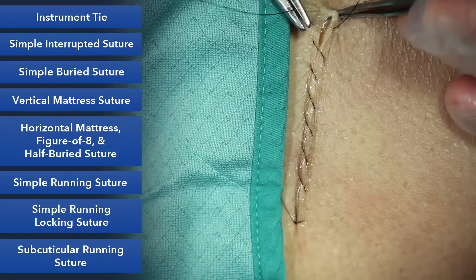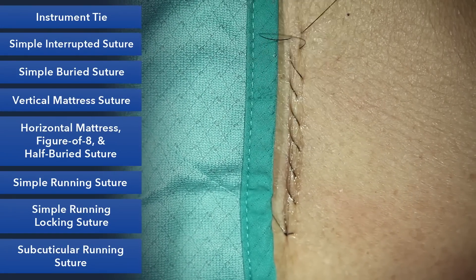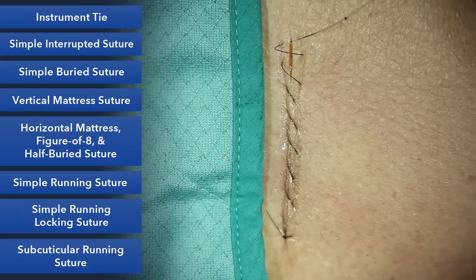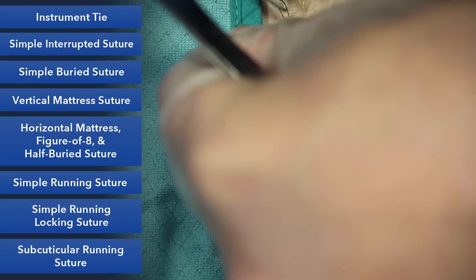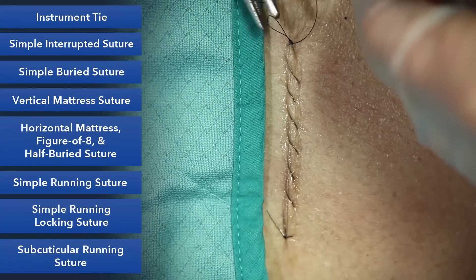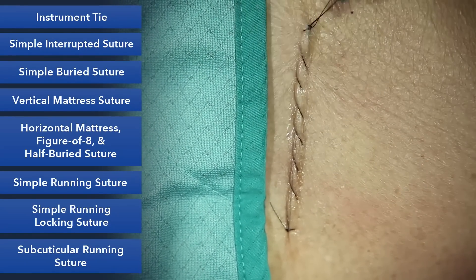I'll end it with a simple little bite at the end. Make sure we have enough tension along the incision and then do our instrument tie at the end. And this is a simple running closure.